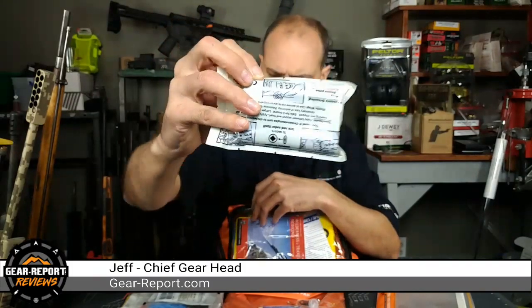The trauma pack, though, is really the more urgent use items. So let's see what we have in here. All right, SWAT-T. Let me try this again. SWAT-T, stretch, wrap, and tuck tourniquet. So this is, I don't know, a big rubber band, you might call it, that can be used to restrict blood flow to an extremity.